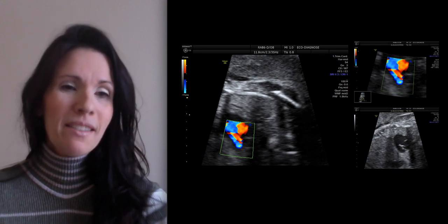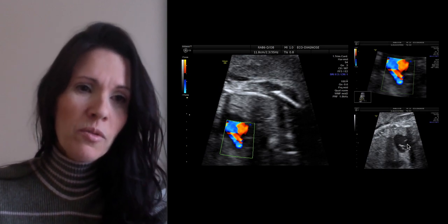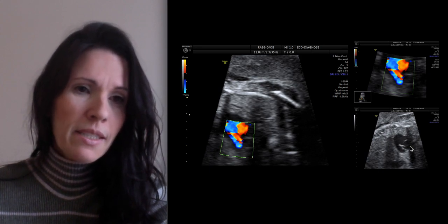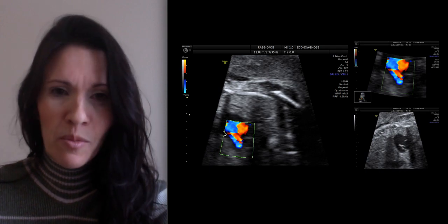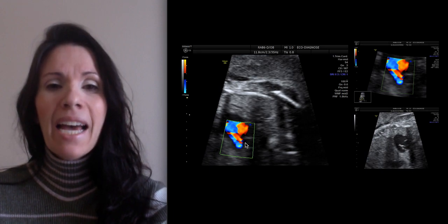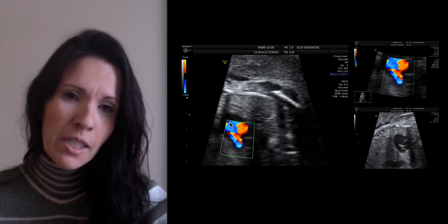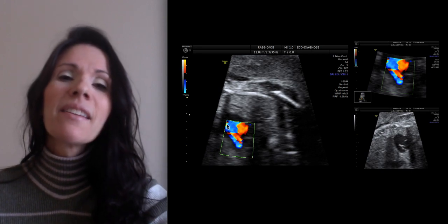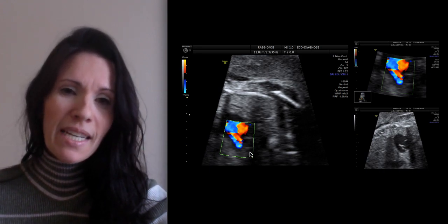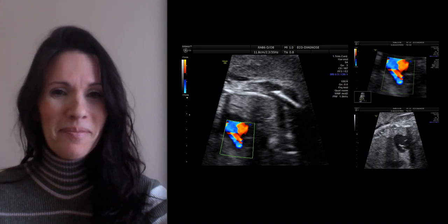And this is very interesting, just to be sure where we are. This is just the atria, but this is the four chamber view. You can see this is the right side, and this is the left side, and I got this image. What is this? This is the flow from left to right atrium through the coronary sinus in this direction, and the flow in blue from right to left side through the septum primum ASD, okay?